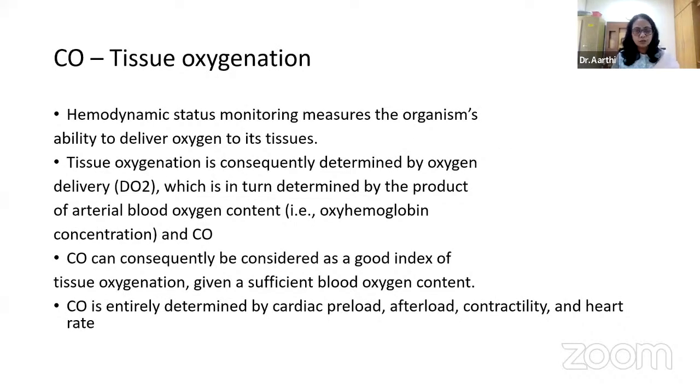So these are all the overviews about the invasive monitors. So now coming to the most important parameter which we assess during hemodynamic instability, which is the cardiac output.